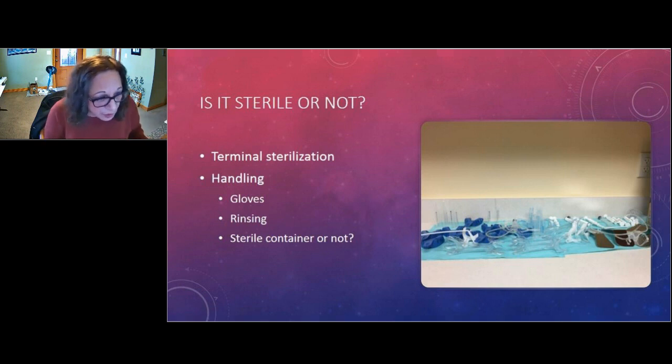And then again, are you rinsing it with sterile water? If it's tap water, it's not sterile, right? So you're introducing contaminants to that item. Yes, I realize we're talking about the mouth. I realize we're not talking about somebody's heart. I get that. But still, you don't necessarily know the status of your patients. You don't necessarily know who's immunocompromised. They may not own up to that necessarily. So you really want to have a larger margin of protection. The best margin of protection for your patients is sterilization as opposed to soaking an item.